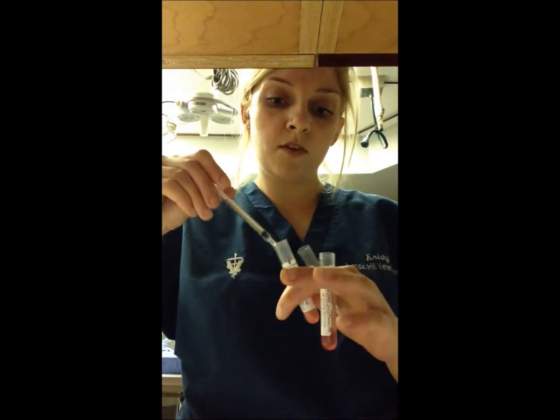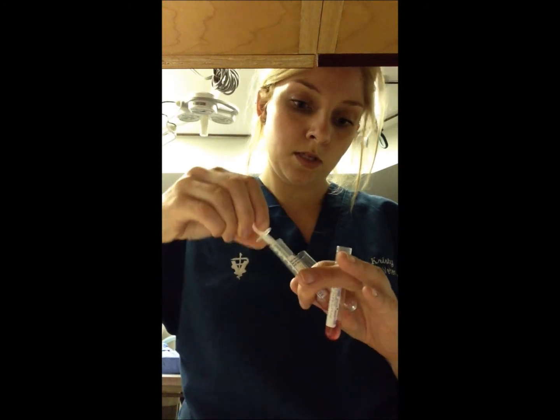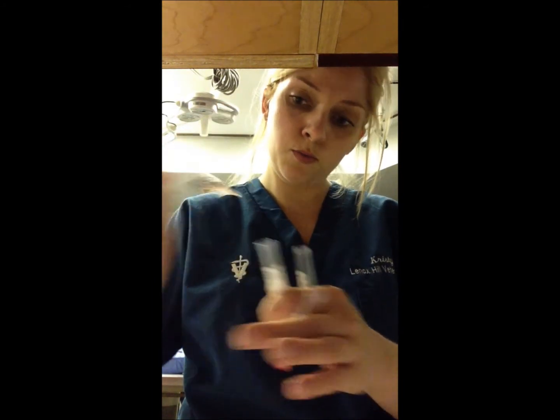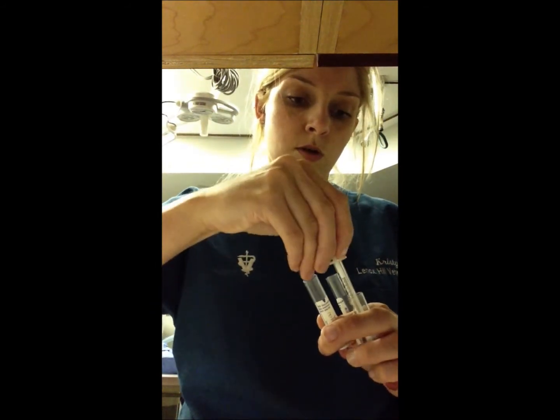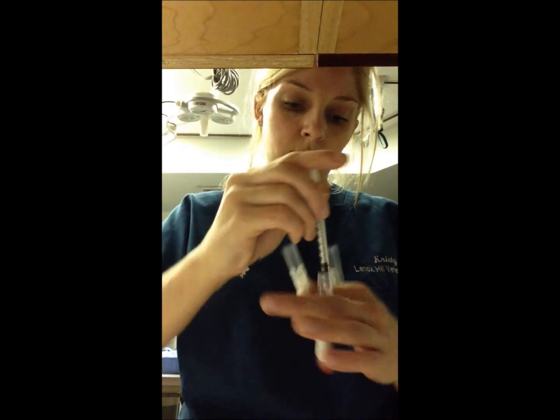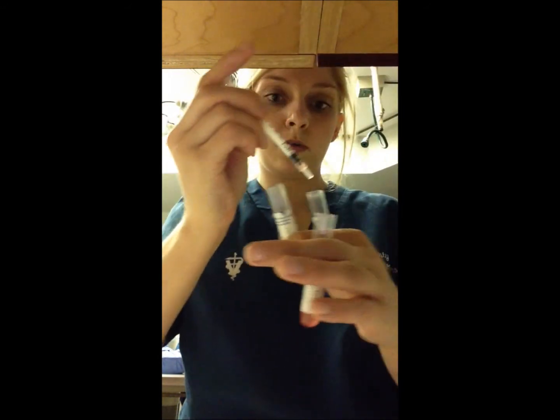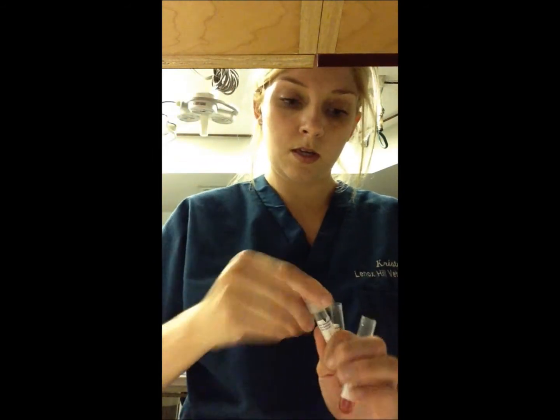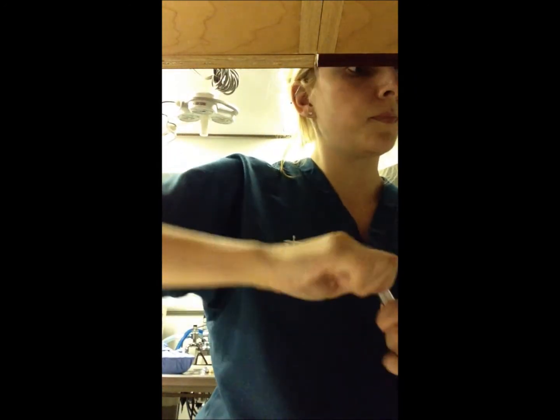So we're going to go ahead and do Ethel's control vial, so 2 drops of her serum, 1, 2. New syringe and 2 drops of her erythrocyte suspension. 1, 2. Okay. Tops. And you're going to let those incubate as well.